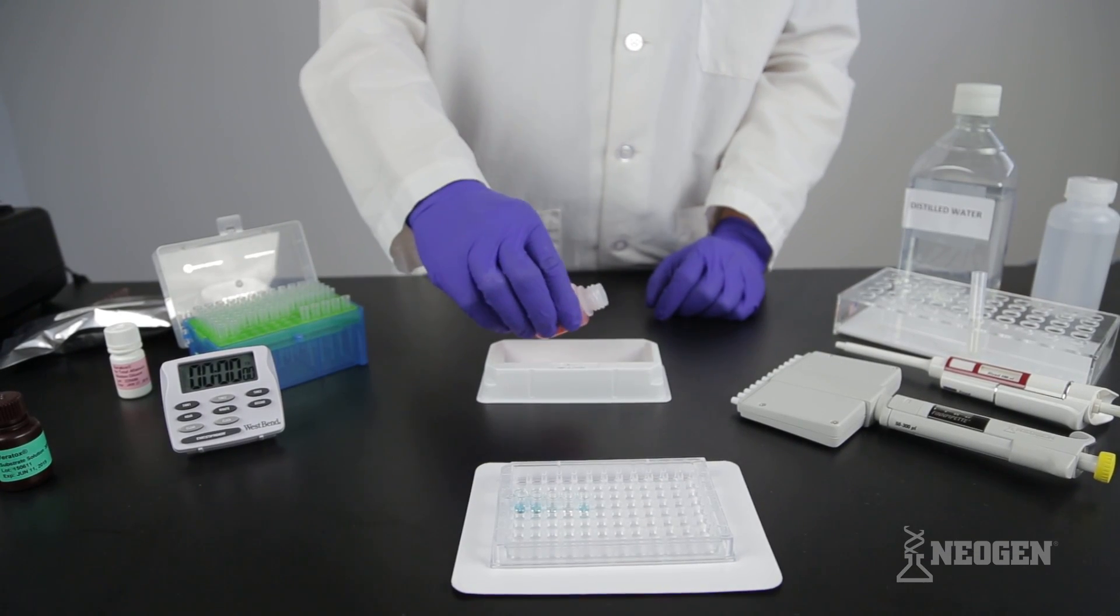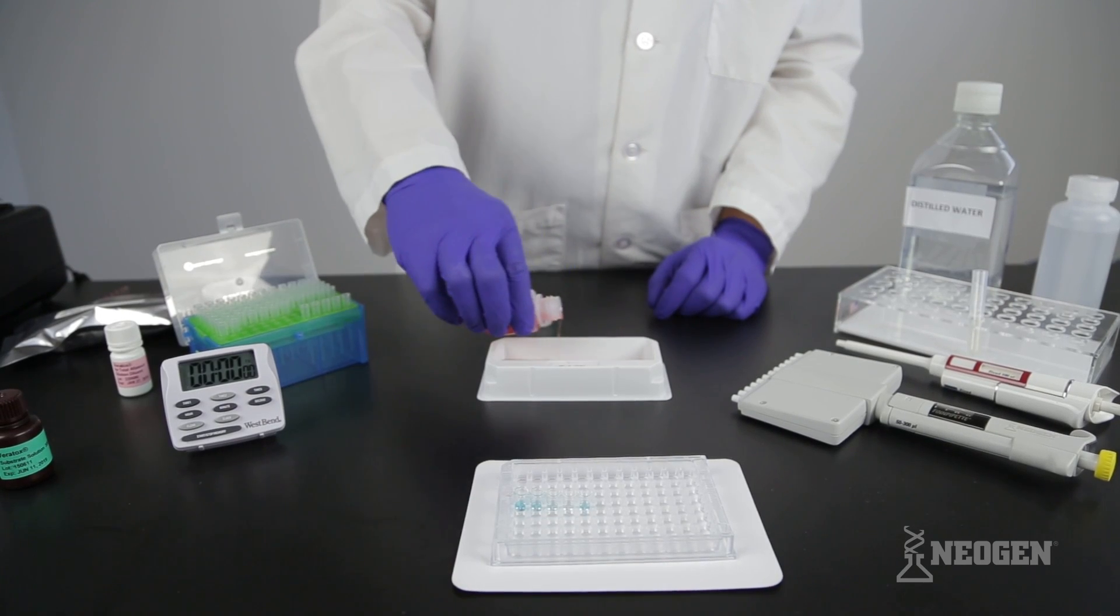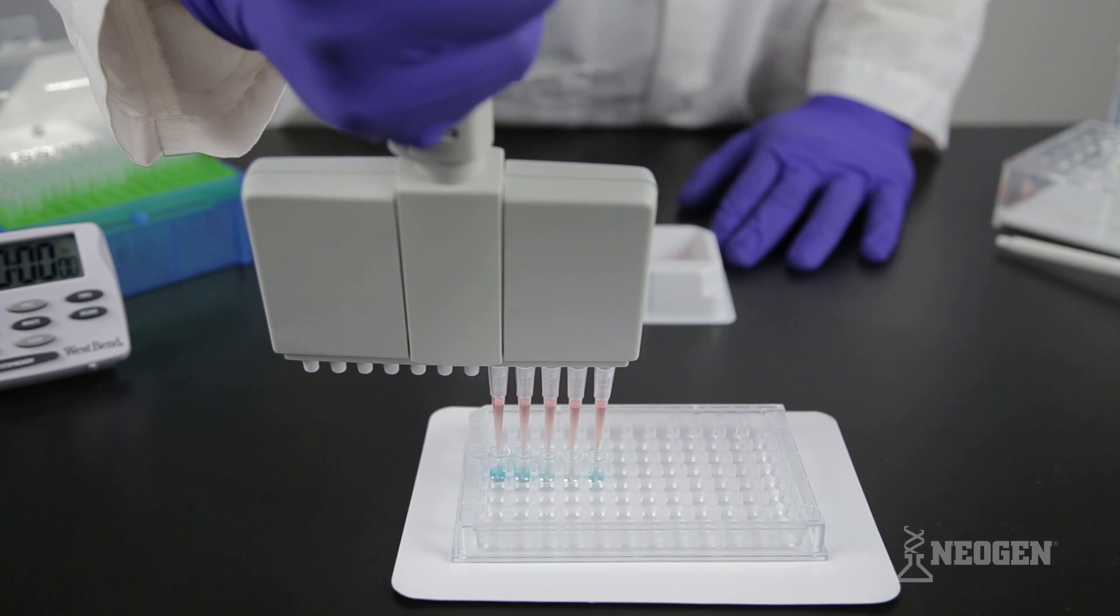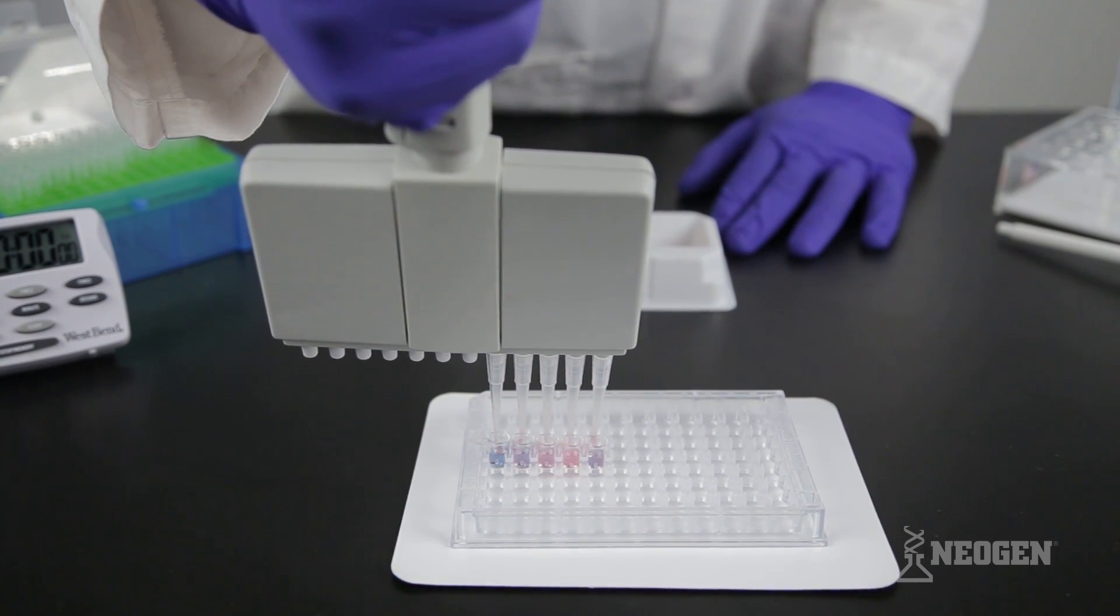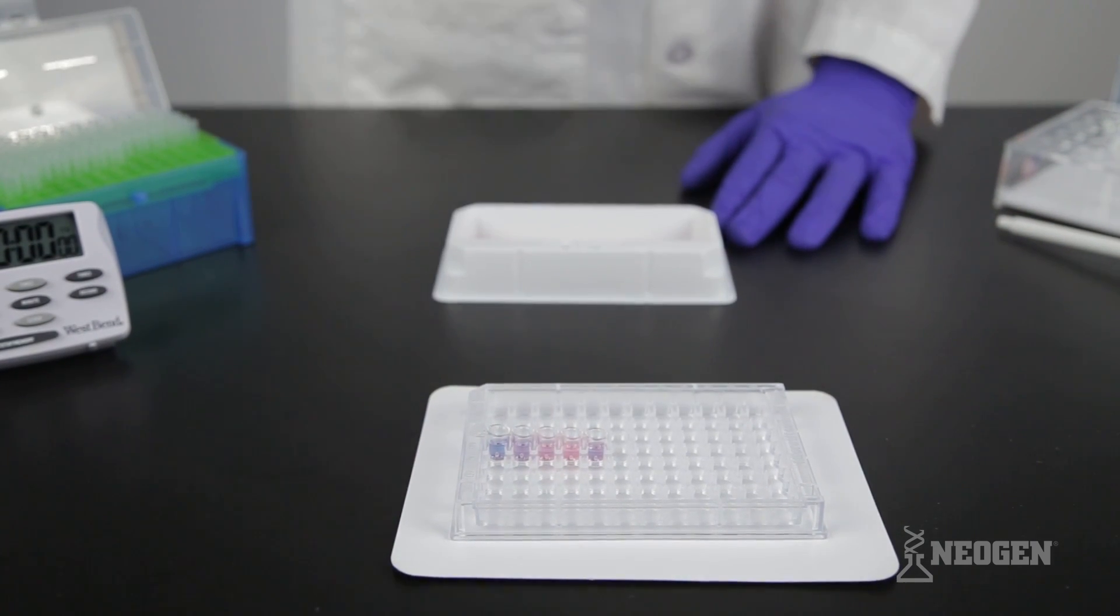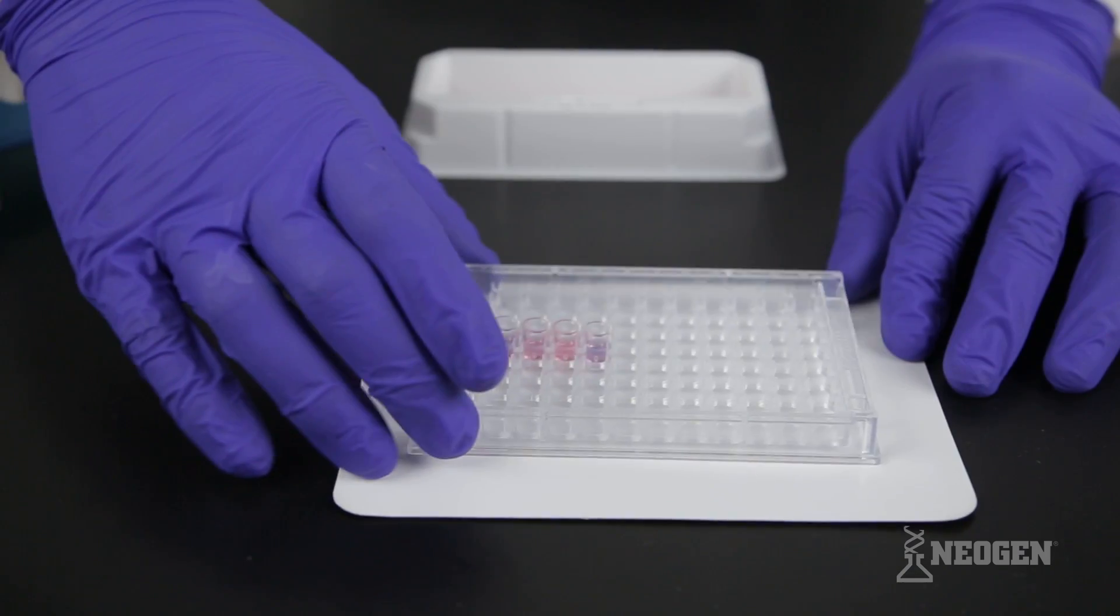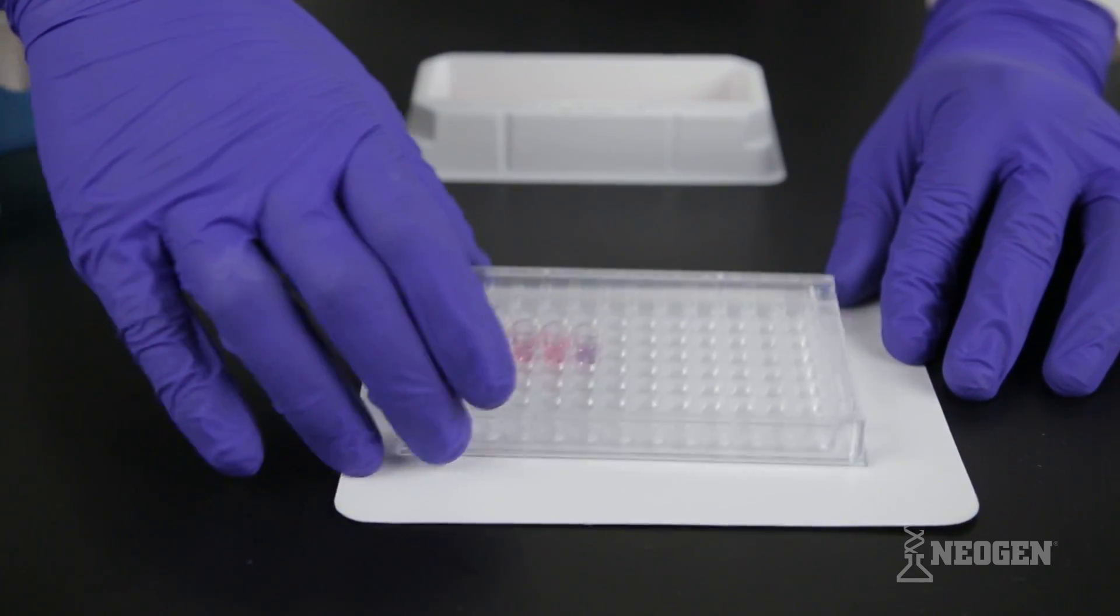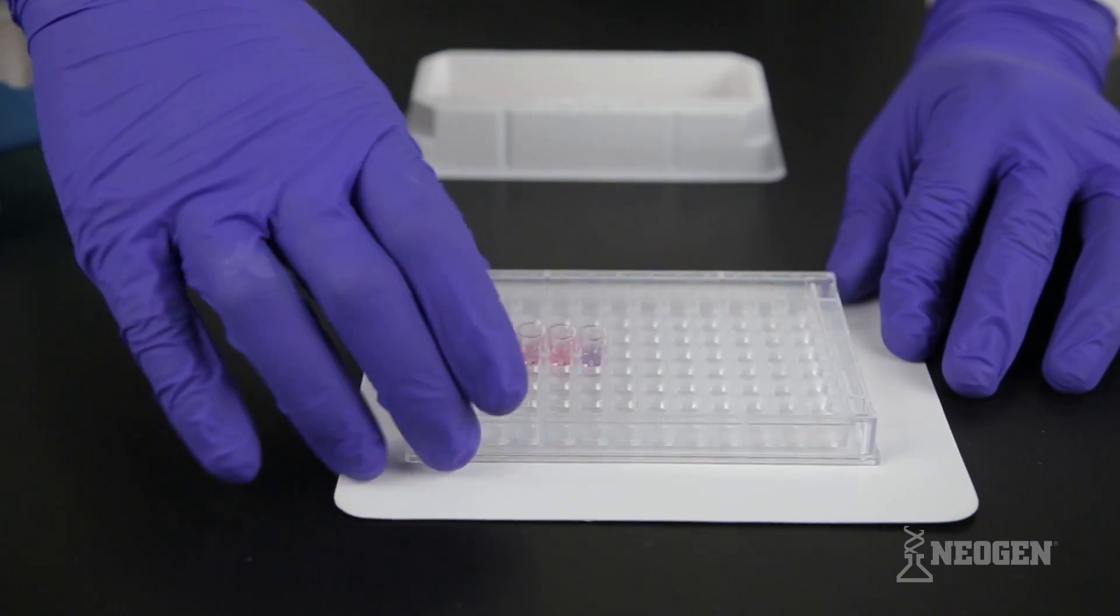Pour the needed volume of red stop from the red labeled bottle into a clean reagent boat. At the end of five minute incubation, add 100 microliters of red stop to the clear wells. This stops the reaction and ends the test. Mix by gently sliding the well holder back and forth. Ensure the liquid is homogenous and there is no layering.